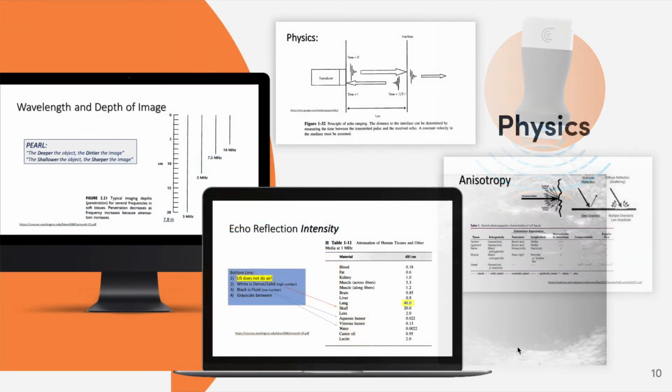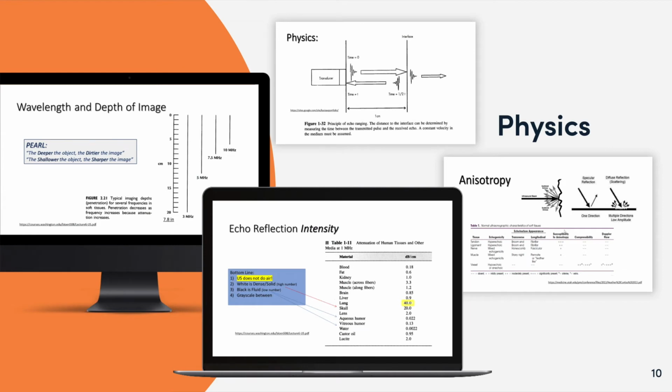I do want to get into two different parts of physics that are important to my colleagues. The first, frequency and depth of imaging. You will see in the call out here that at 3 megahertz, images can be generated as deep as 7.8 inches. Now, for my colleagues that utilize this tool for heating and metabolic reactivity within the body, we in essence use the friction that's caused by a power intensity that's close to 200 times as strong as imaging ultrasound, but we use it on surface tissues.